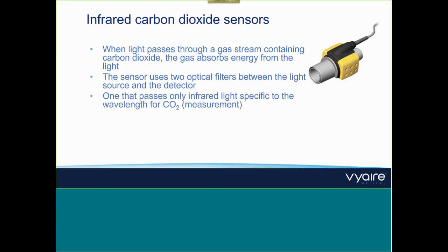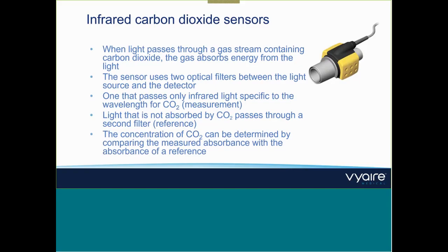And when you use, for example, nebulization, the light is emitting differently because of the nebulization, so potentially the result will be affected as well, or the capnometer won't even measure anymore. And so it's very, very important that the adapters should always be new, always used once on a patient, to just guarantee that the CO2 measurement is going smoothly. And that's the reason why we need this adapter, and otherwise without the adapter the capnometer won't work.